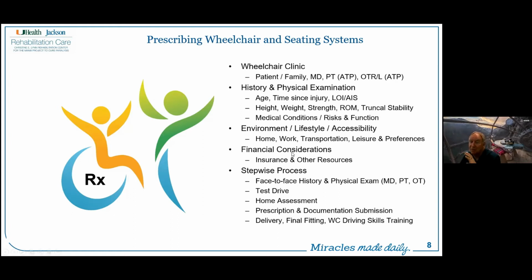So the stepwise process for the client is a face-to-face history and physical examination with the physician, as well as the therapists. And that includes a MAT evaluation. It includes trial and error in terms of the person's balance, truncal stability, and postural supports that may be needed.